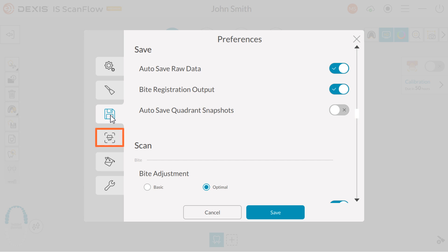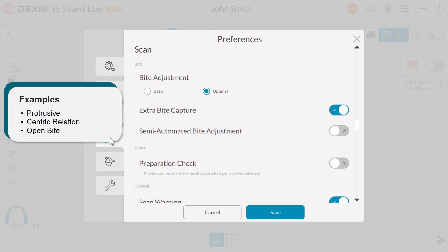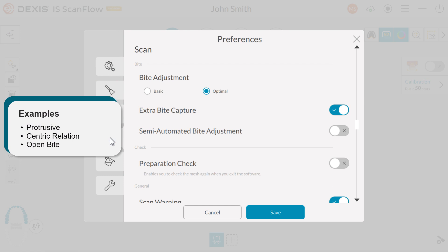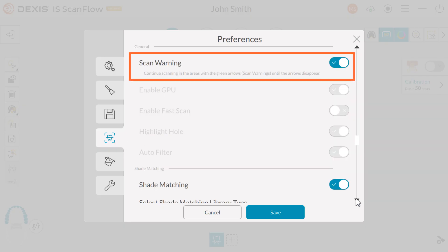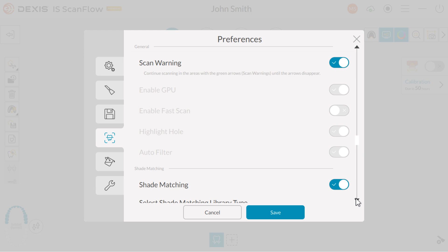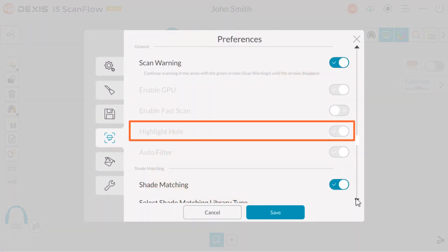Next, click the Scan tab. Under Scan, you have extra byte capture — enable this feature when more than one byte registration is required. Examples could be protrusive, centric relation, or open byte. Scan warning, which is routinely enabled, displays green lines and red arrows indicating areas of weak connections among tooth surfaces, which might cause an image stitching error. Highlight hole highlights a boundary around areas missed in scanning, producing a hole as a result. This feature is routinely disabled when the background color is not enabled.